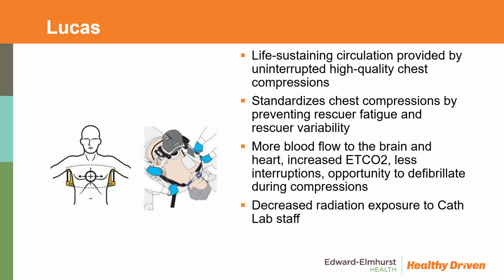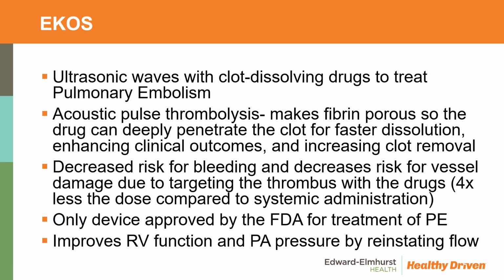So if you think about it, we do have to get creative with the angles of our C-arm. However, it does give one person an opportunity to be running around helping out in that situation instead of manning compressions.